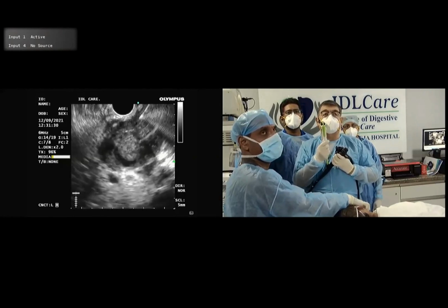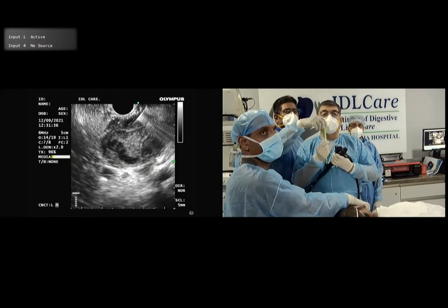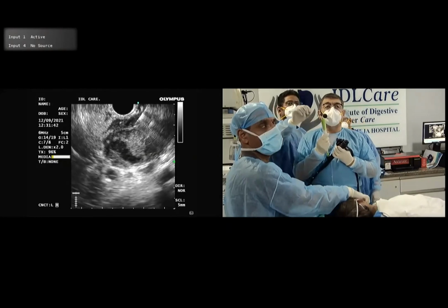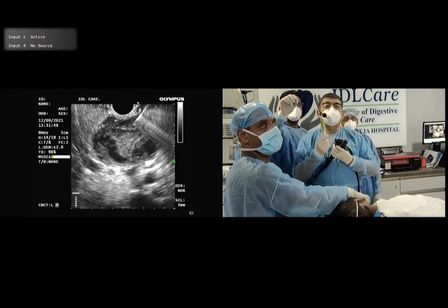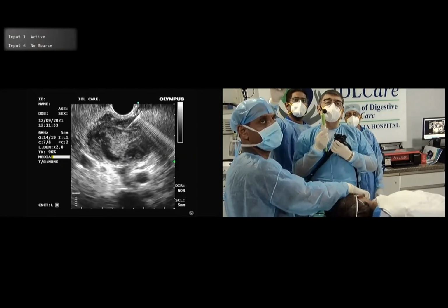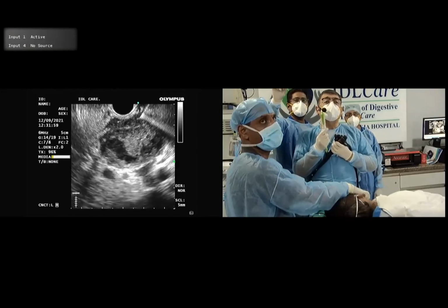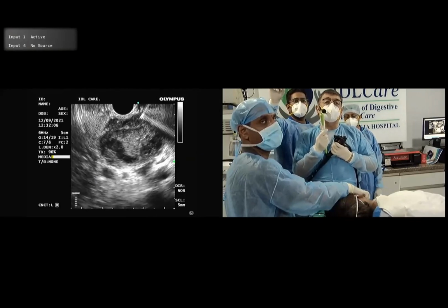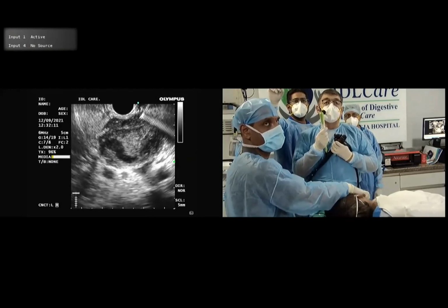See, we are in, we push in the stylet a bit, and I always use a slow pull technique. I never use any other technique. The double door and door knocking and all those are nice. So remember, once you have gone in one direction, don't go in this direction again, because once you have gone in a direction, the needle goes in and comes back. It creates a very minor empty space, which is always filled with blood. So change your direction, go in another direction.